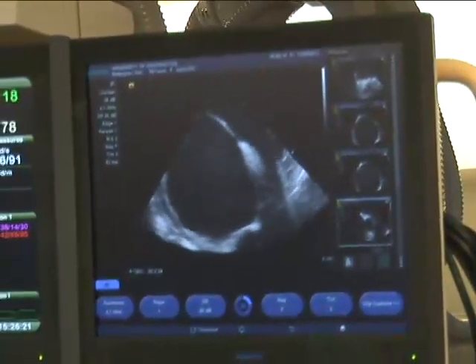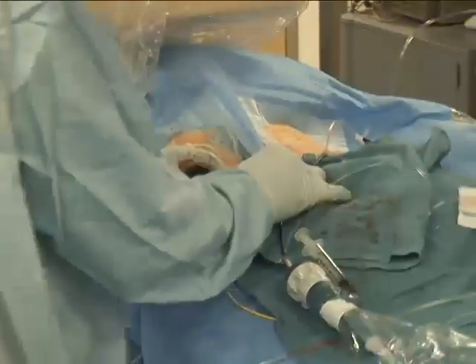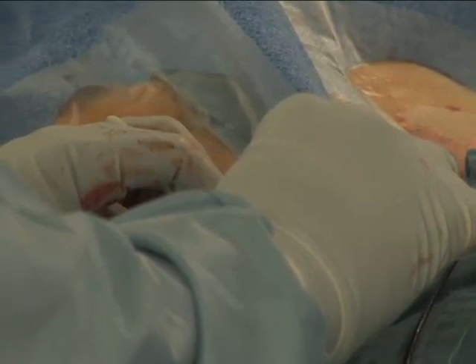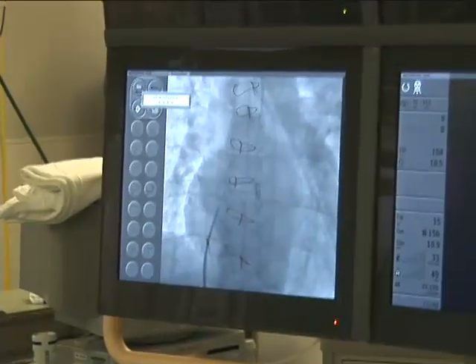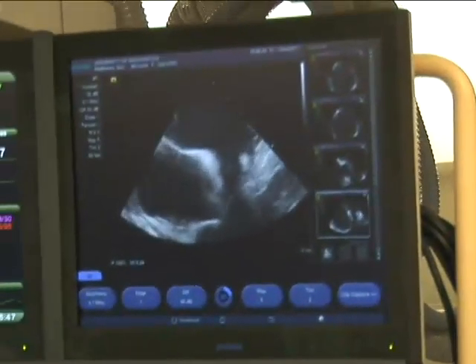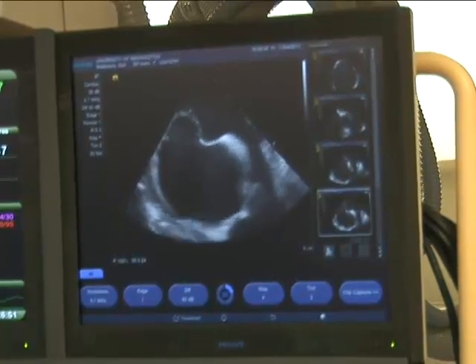There are typically 2 drops of the catheter, which may be seen and palpated. The first occurs as the catheter drops over the aortic knob, also identified by the pigtail catheter in the aorta, and the second occurs as it falls into the fossa ovalis of the atrial septum. With the slight advancement of the transseptal catheter described above, tenting of the atrial septum should be visible. If this is present and at the desired location, then continuation of the transseptal puncture may ensue.